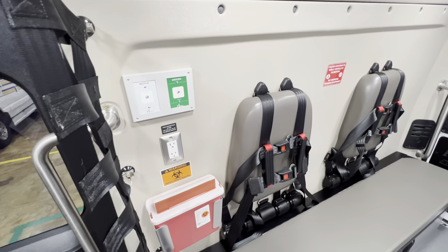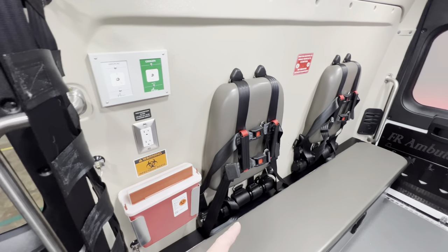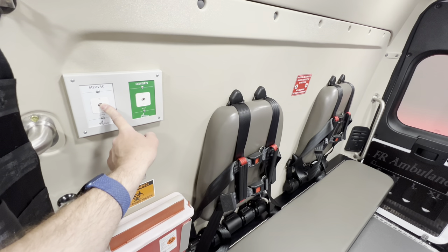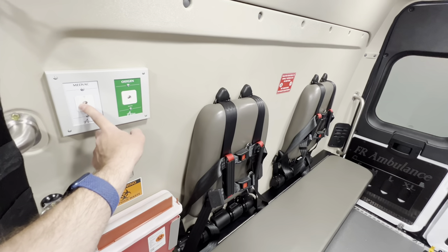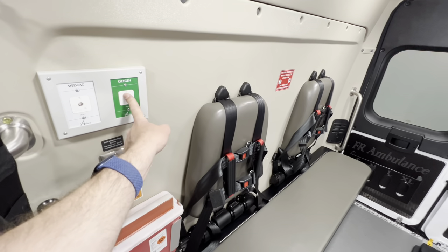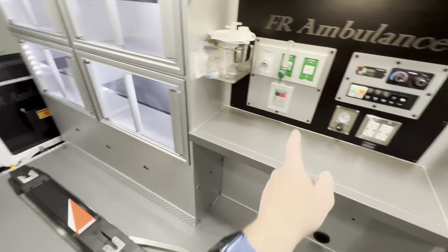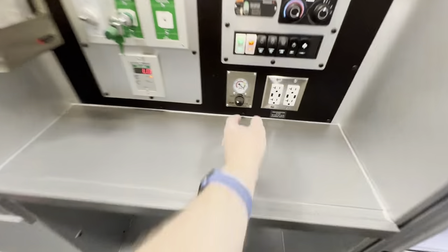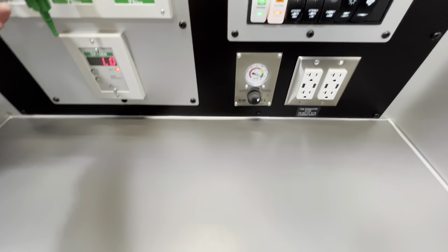On the squad bench seat, there's a suction unit and an oxygen port. So you can hook up your suction bottle here and your oxygen bottle here. You have outlets here as well as several outlets on the action area. Your suction regulator is here so you can control that.